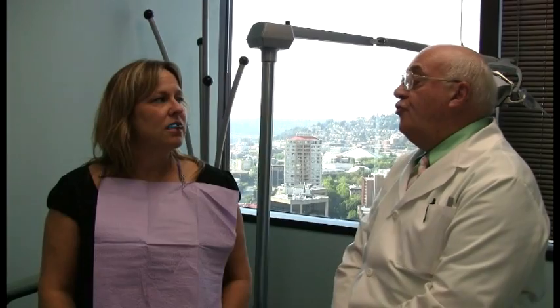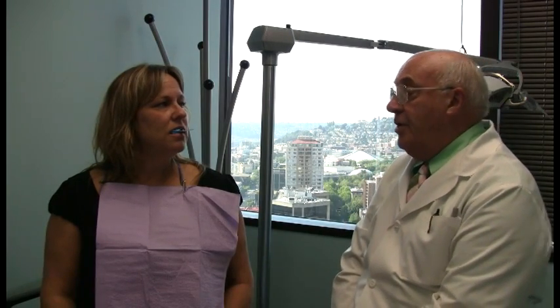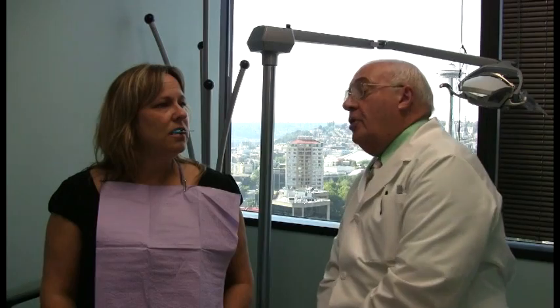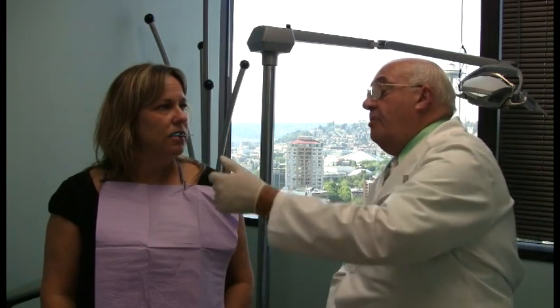The nice thing about this system is I've used a George gauge for years, but we all know that a George gauge has a vertical alternative of 2 or 5 millimeters, and I spent a lot of time using light cure resin to change that vertical if I wanted it higher, more vertical. And in this way we just picked the mandibular positioning simulator that matches, or the ones that we got the best reference on, and put the bite fork and the handle on it, and we've already got our treatment bite.